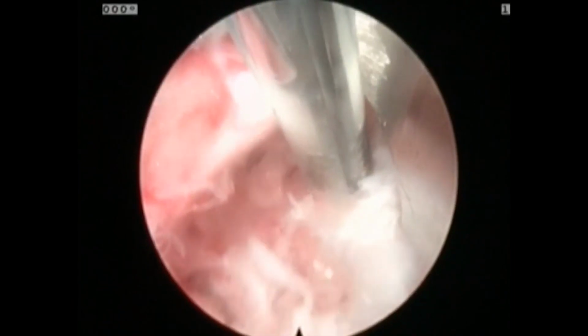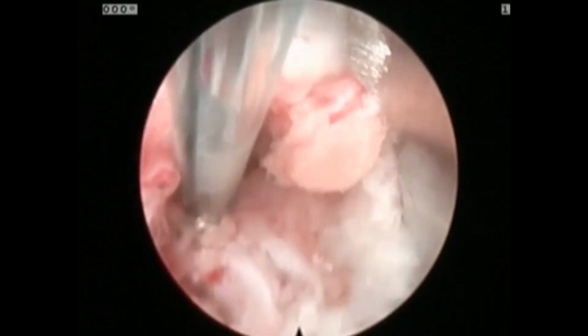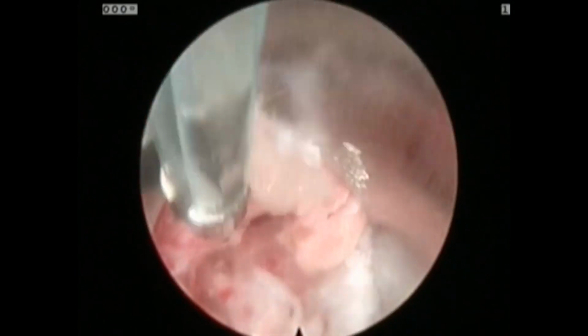This is an exiting L2 nerve root. This is vertebral body. There's some epidural venous bleeding that I'm coagulating, and I can reach underneath the nerve root. There's an osteophyte that I need to get, but you can see very nicely the nerve root.